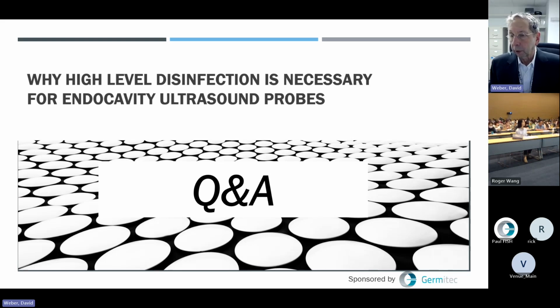It's been used for food surfaces for decades, used in ventilation systems for purifying the air, and more recently used in medical devices such as the UVC chambers that we mentioned for high-level disinfection of probes.